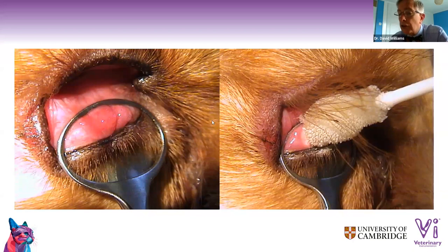There are people. This is a rather old picture where we tried a cryo probe that just came with a little squirt of gas going into there, and that worked sort of reasonably well. I must admit, now we've got a cryo pen.